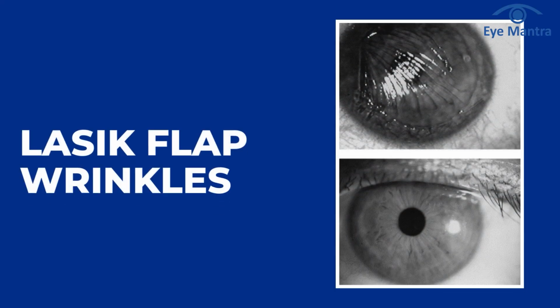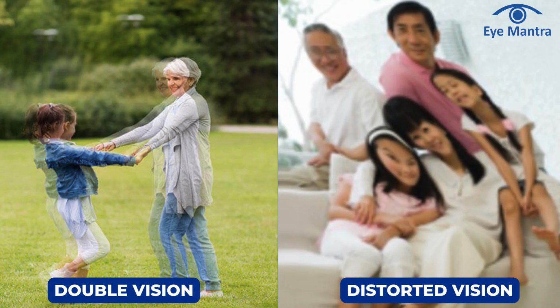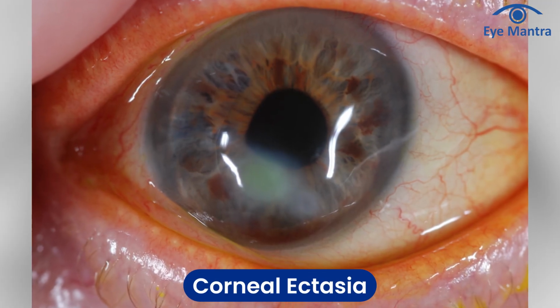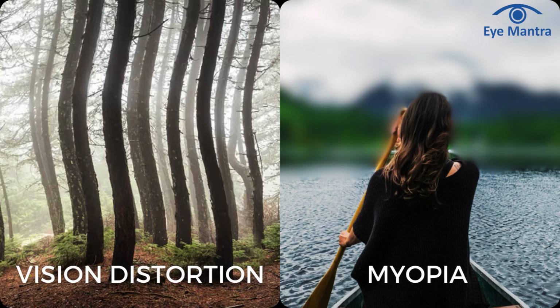Flap wrinkles or flap striae occur when the flap does not heal properly. If the flap heals irregularly, the patient may experience double vision or distorted vision. Wrinkles in the flap can reduce clarity, affecting high-definition vision. Corneal ectasia is also a serious complication. When excessive corneal tissue is removed, the cornea becomes weak, leading to permanent vision distortion or progressive myopia. In extreme cases, corneal transplant may be required.